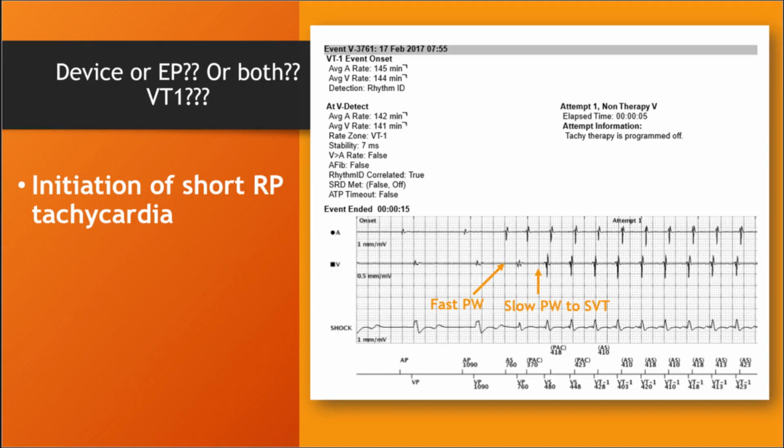Now this patient has a device with an atrial electrode and a ventricular electrode, and these devices have the capacity to do a basic EP study without any further invasive procedure. So we can use the device alone to further our understanding of the patient's needs and none of the risks and costs associated with a traditional EPS study. Wonderful! Amazing! So let's go one step further.